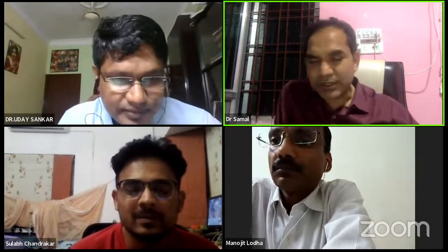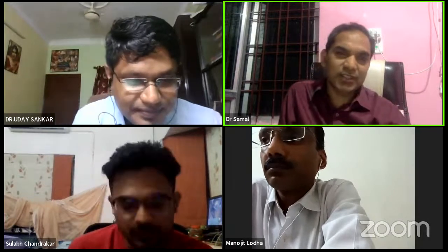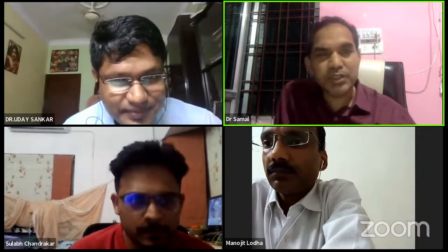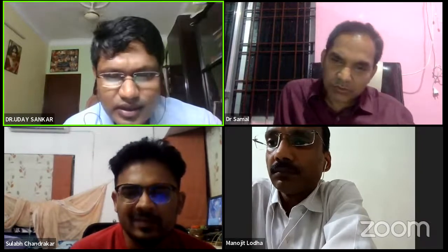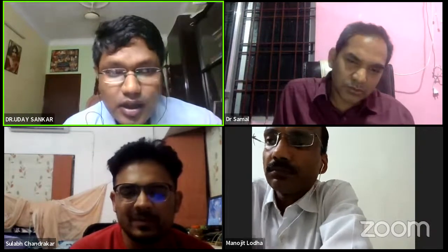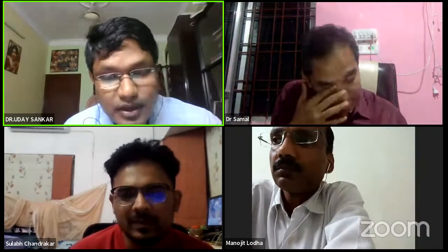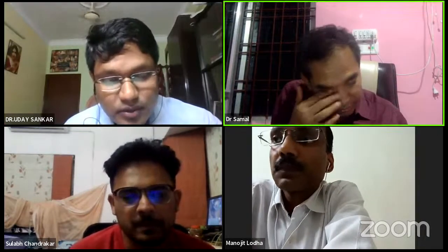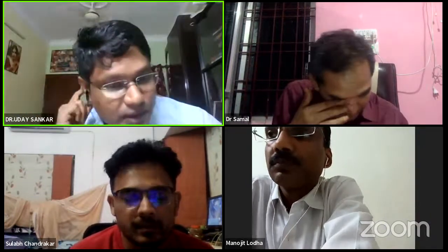Yeah, I think that is an excellent case. The patient survived. That is one thing excellent. And what about, did you use the GP2B in this patient? Yes, for the second case I used the tirofiban. In the first case I thought it's not very thrombotic, so initially I did not use it, but whenever there was slow flow after ballooning I used that. But in the second case, from the start I used the GP2B.